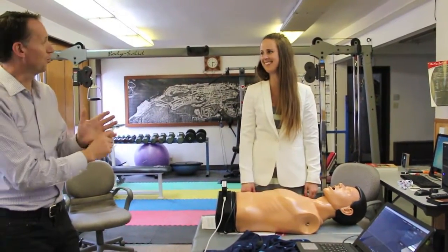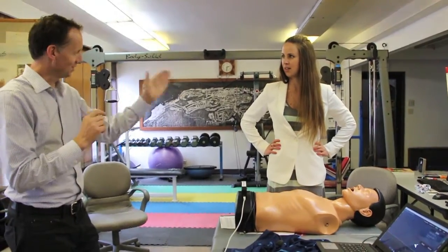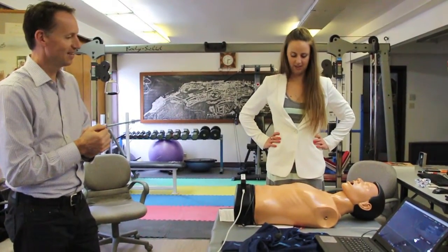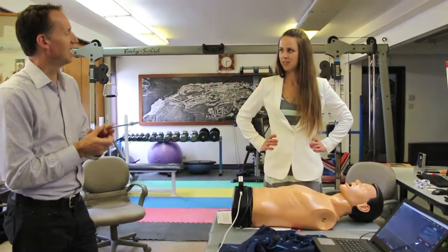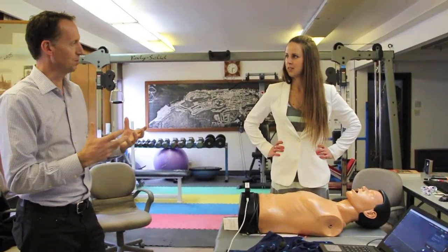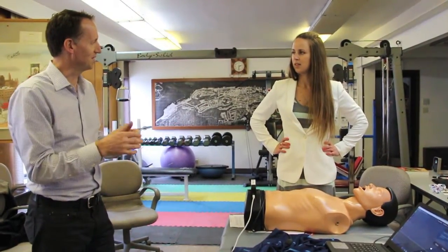Yeah, it's a workout! So what did you learn from this? A lot more pressure than I thought. Great. And a lot faster than I thought you'd have to go. Great — that's very common. People who've taken a CPR course before know a few of the basics but they don't have all the pieces together.